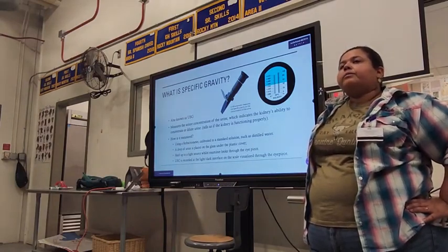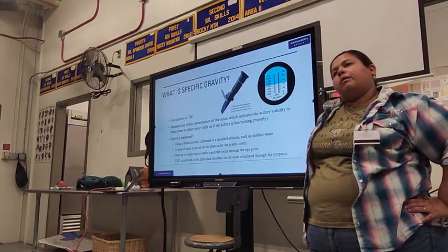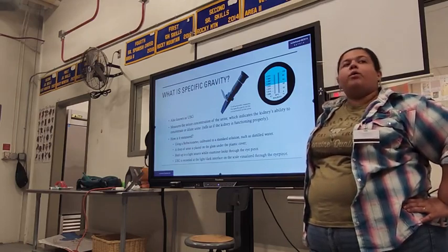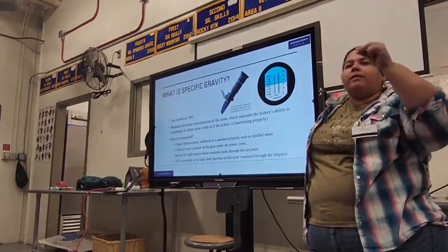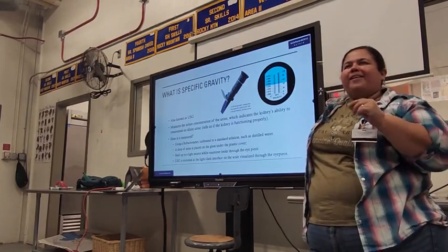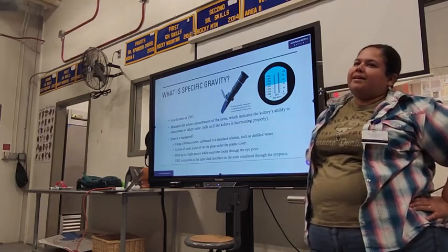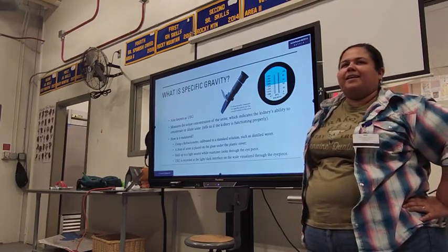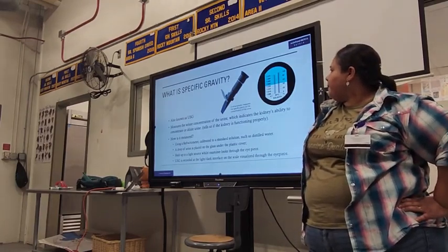Would it be better if you literally pee on a cup and you just put the drops yourself? Or you literally pee on it? Oh, you don't pee on it. You use a pipette, a little dropper. No, that'd be a mess.